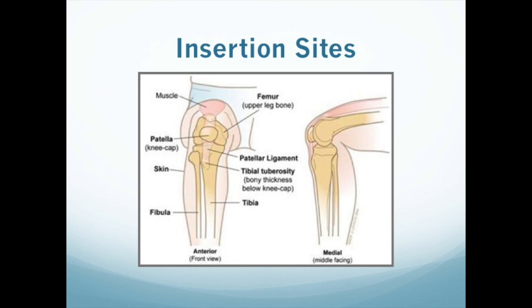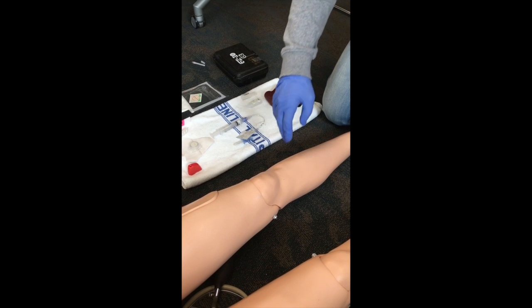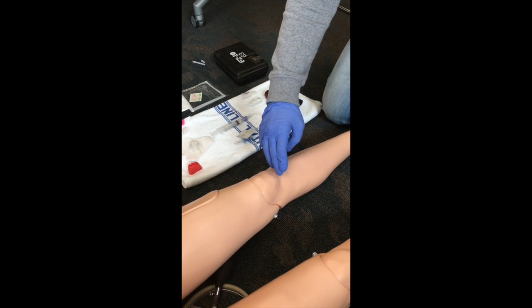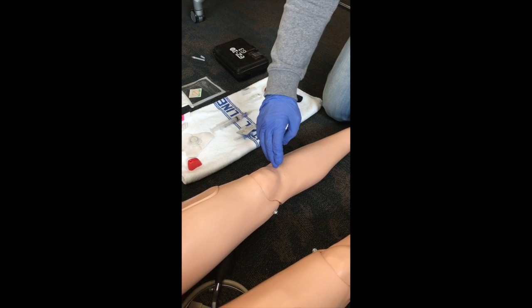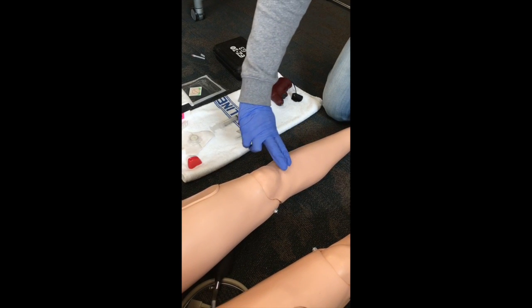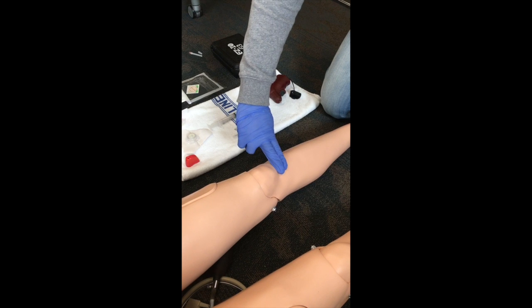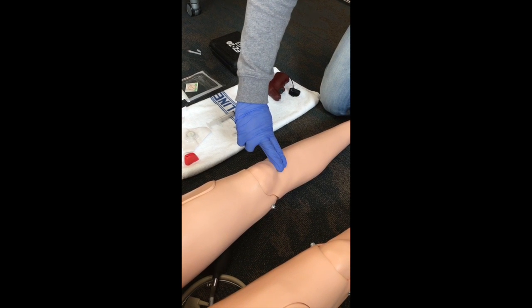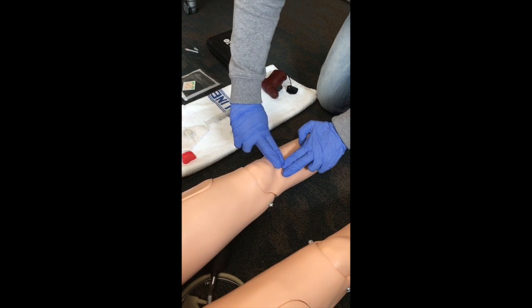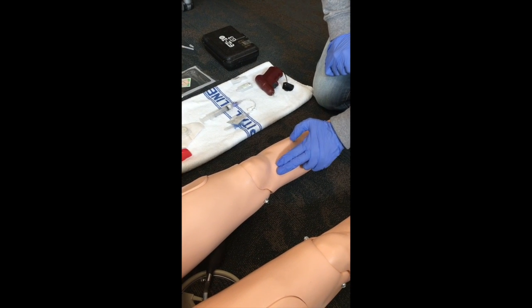Our final insertion point is the proximal tibia. This is located three centimeters below the patella and one to two centimeters medial to the tibial tuberosity. This is the location we're going to be demonstrating today.